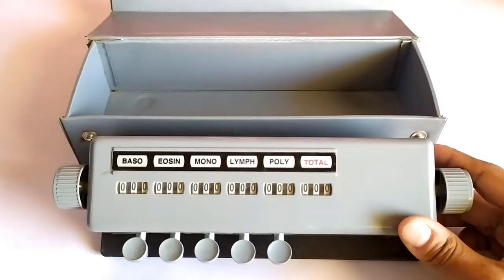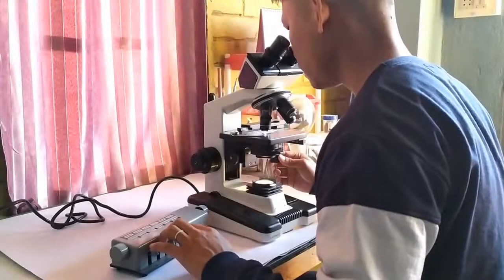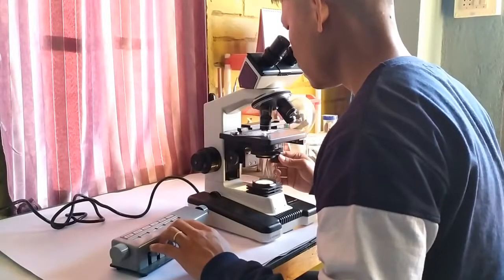In DLC count, 100 cells are usually evaluated. In this regard, a convenient feature of the cell counter is that once the total count reaches 100, the counter makes a single loud ring using its inbuilt ringing bell, much like the calling bells used in office spaces. This allows us to perform an undisturbed counting without having to constantly check the counter to see whether or not the total has reached 100.